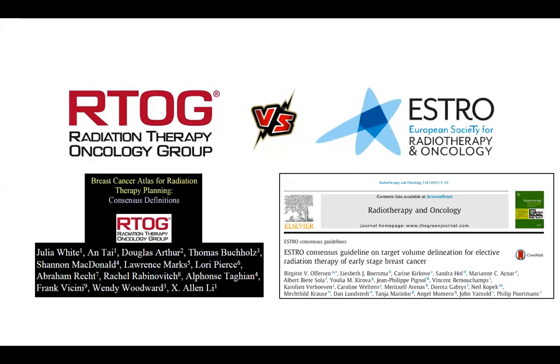I think it will be discussed tomorrow, isn't it? Yes, sir, tomorrow it will be discussed: what the major differences are between ESTRO and RTOG, where both guidelines fail in covering the pattern of recurrences, and where we need extra boundaries and extra margins apart from ESTRO and RTOG.